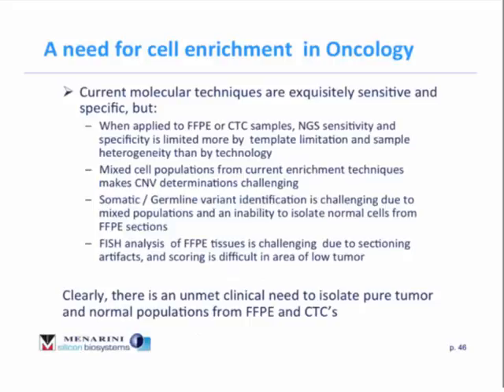So really the question is, why would someone in a clinical lab want to validate another sample preparation device? There are absolutely many out there, so why would I want to do it? And really the answer is that when we look at our technologies, our current molecular assays, our qPCR, our microarray, our NGS assays, on the sample types we get, these assays are exquisitely sensitive and specific. However, the final performance characteristics of these assays are not so much determined by the instrument as they are by the quality of the sample input from clinical samples. And this is especially true for FFPE tissue or CTCs.